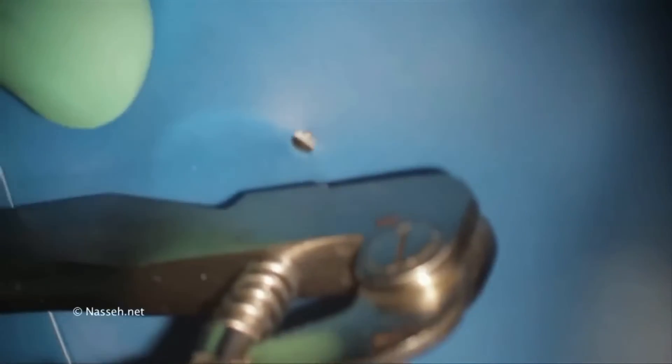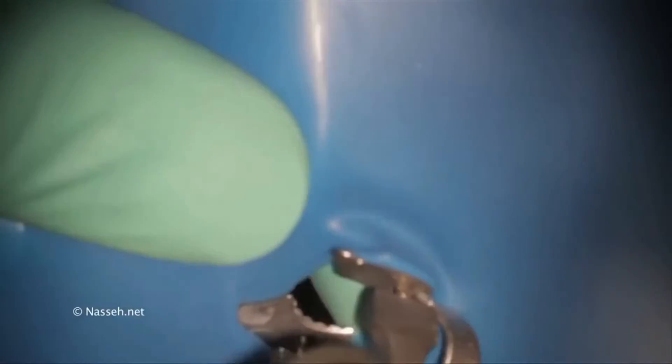Hello and welcome to another tutorial. My name is Dr. Alina. I have a quick tutorial on the use of split dams in endodontics, as well as its application for regular restorative dentistry. Oftentimes a single hole is made in a rubber dam and the tooth is isolated individually; however, when the tooth cannot be clamped, a split dam technique is used.